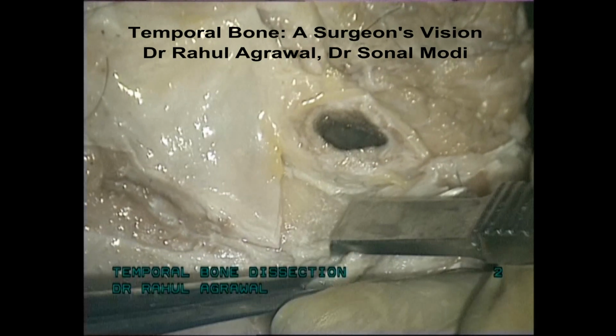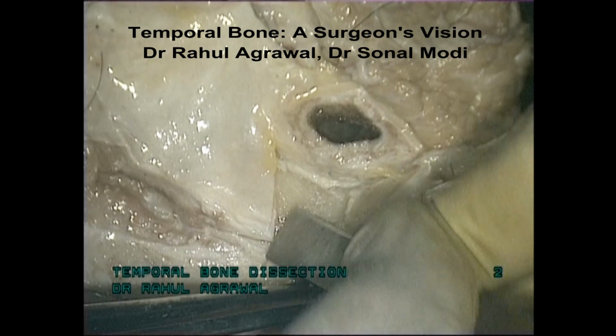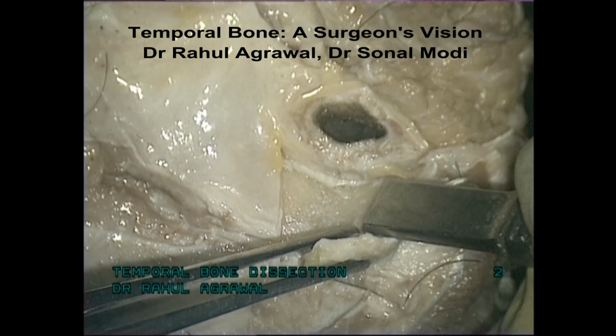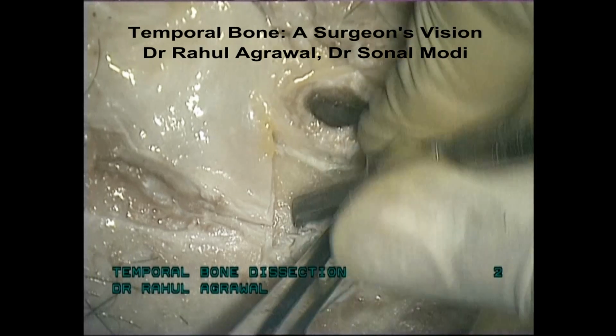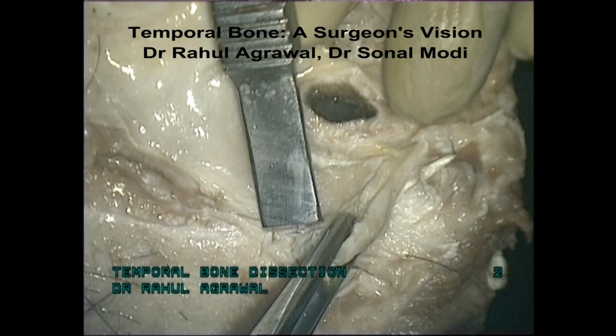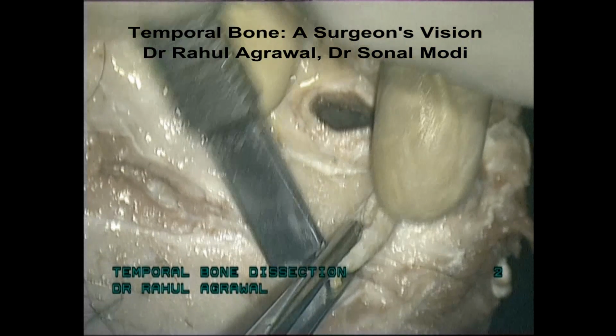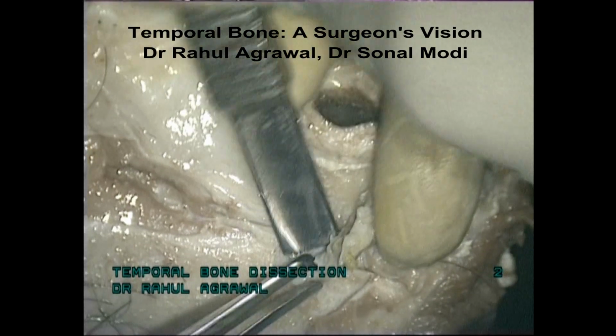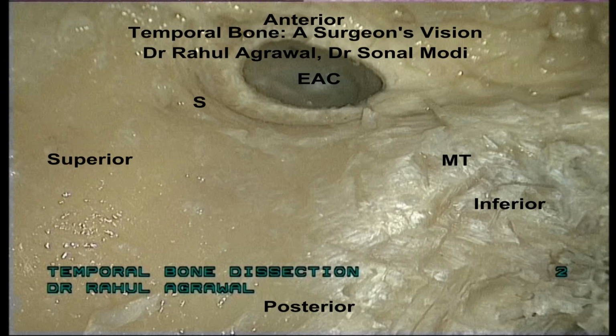It is important that you practice this step on cadaver, but before starting the dissection, remove all the soft tissue from the lateral surface of the bone so it becomes easier to dissect and the soft tissue doesn't come in your way when you're drilling the bone. Soft tissue from the lateral aspect of temporal bone has been removed.